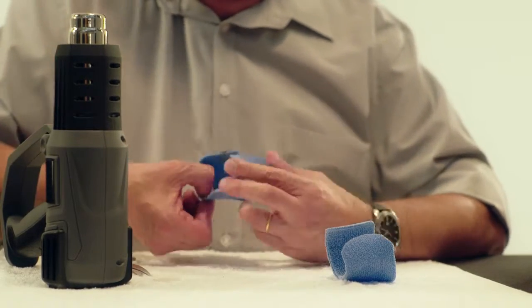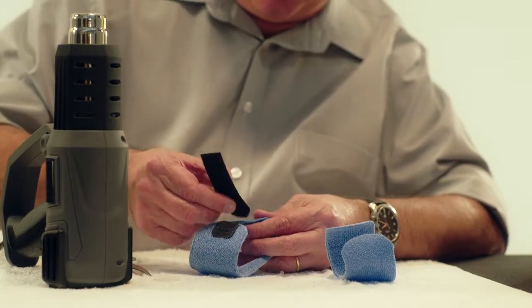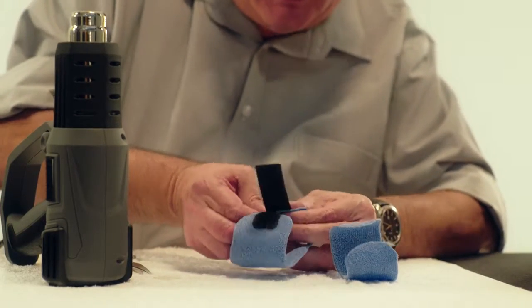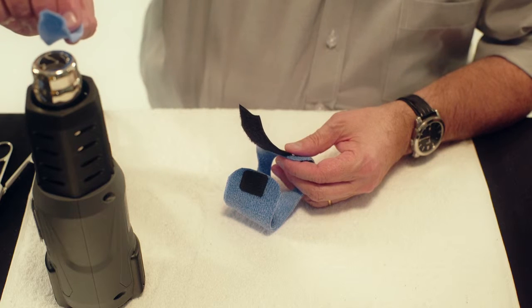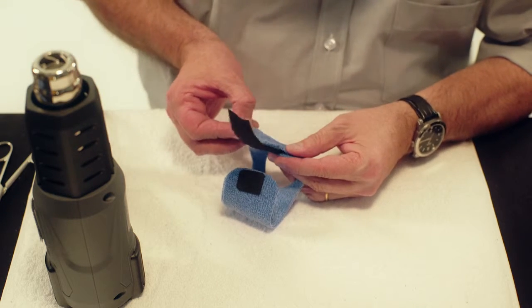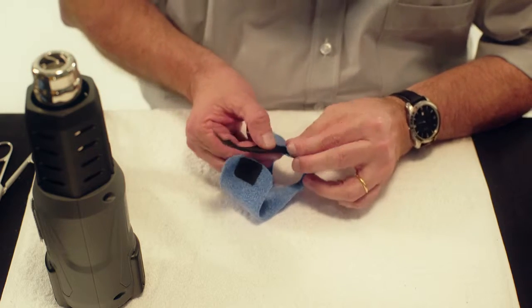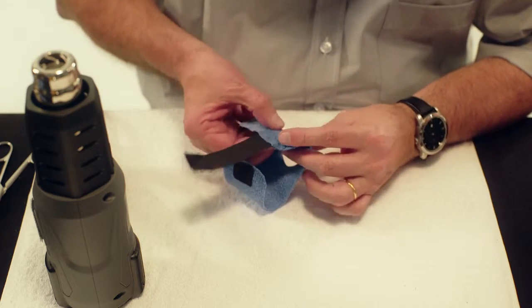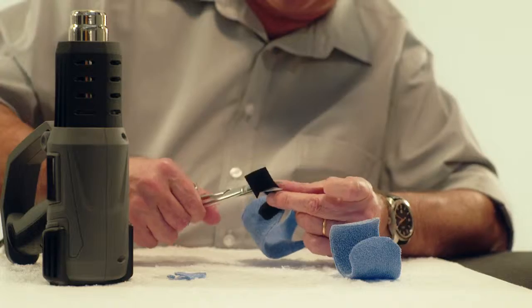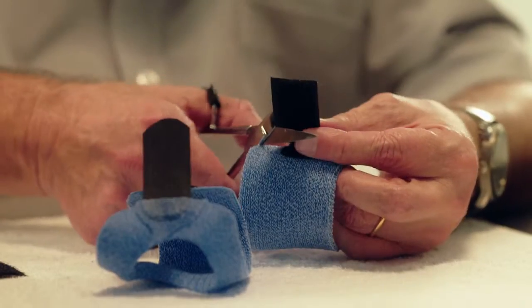Heat the other side with a heat gun and stick a piece of Velcro loop with the fuzzy side down onto the orthosis. Secure the Velcro loop by heating a small piece of Orficast with the heat gun and stick it over the edges of the Velcro loop. Do the same with the other part of the orthosis. Round the corners of the straps.